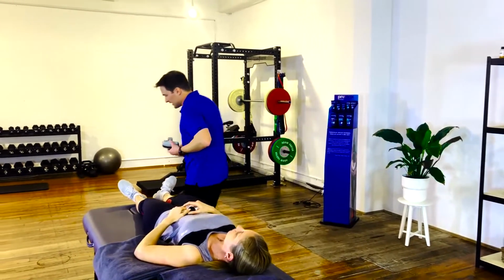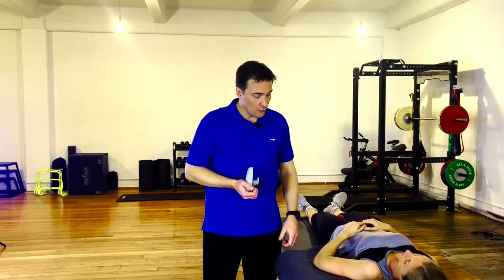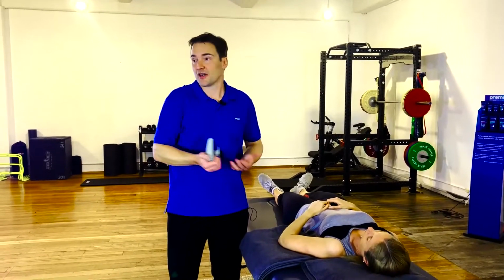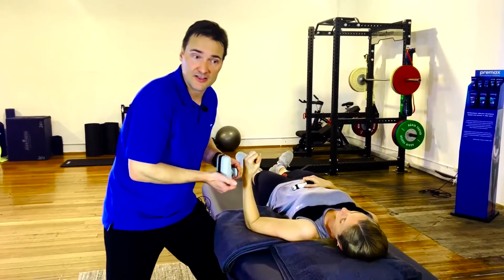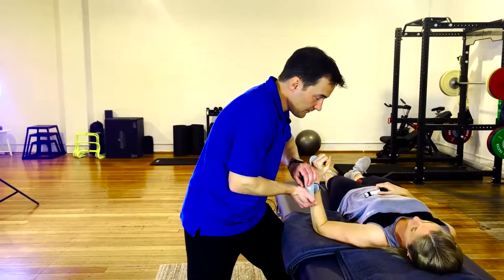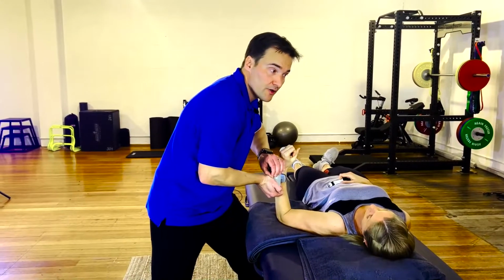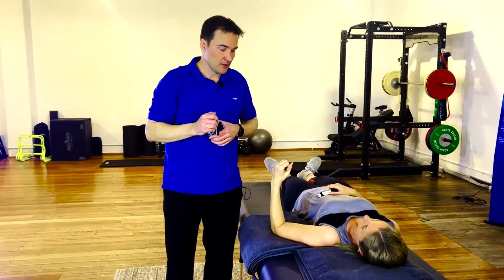All right, so let's talk about some other questions that you may have. If we stick to this example of external rotation strength, another question you might have is, what about a break test? So there's a make test and a break test. I'll demonstrate what these are. What we've been doing so far is simply a make test, and the instruction is to match my resistance. You're trying to just keep it isometric the whole time, so you don't have to go as hard as you can, but just match my resistance. There's minimal movement, and this is really useful for measuring the slope of the curve, so how quickly they can put the force on, which is rate of force development. You do a make test.